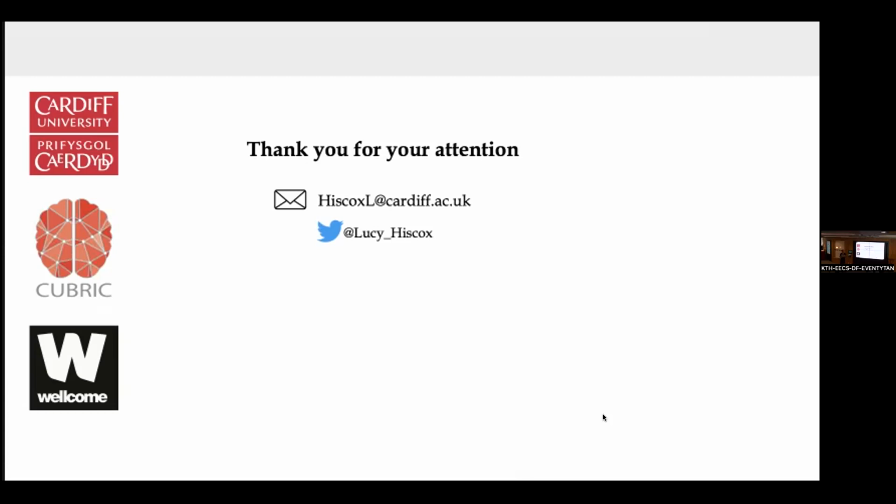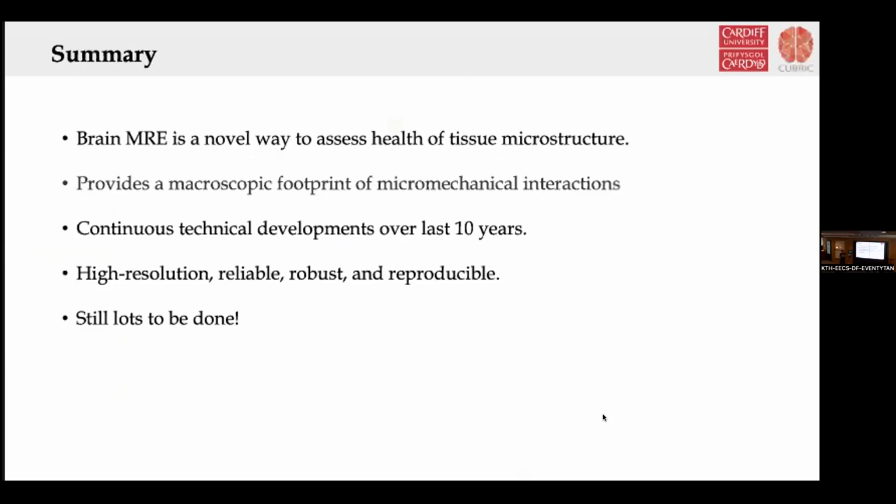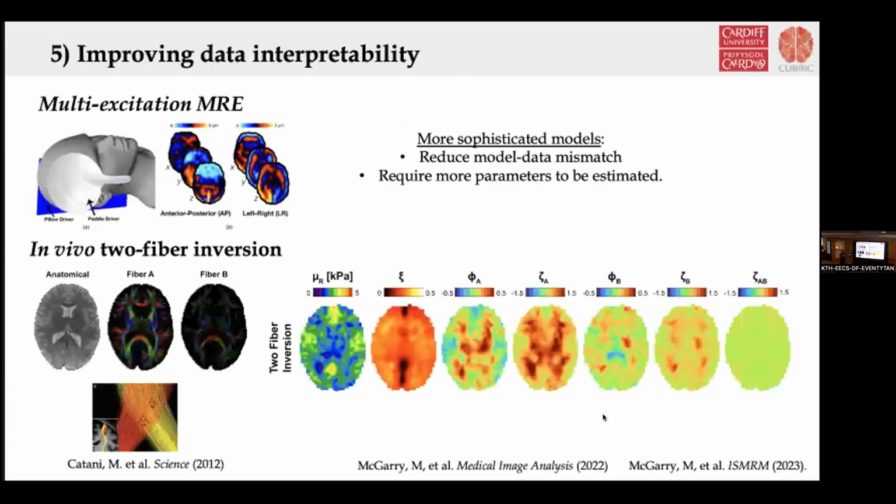But on the last slide, if we can start to use the fiber direction from DTI, especially the primary and secondary fibers, it relaxes some of these assumptions. So we'd be more able to have a reliable measurement of white matter tracts, which we haven't had previously. Does that answer your question?